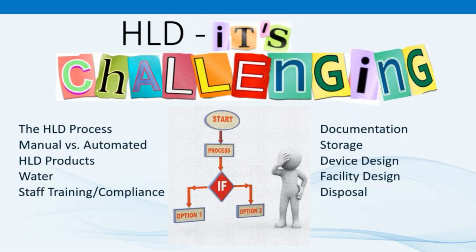So to navigate HLD, we needed to identify its challenges, and there are many. The HLD process has multiple steps within each step. Manual versus automated HLD each have their own protocols, products, IFUs, and issues. HLD products, the disinfectants, enzymatic cleaners, detergents, and test strips each have their own product-specific instructions for use and a whole lot more. Then there's water and staff training and compliance and documentation and storage and device and facility design and solution disposal. So there are lots of moving parts and steps with HLD, plenty of opportunity to miss a step that could result in patient harm.